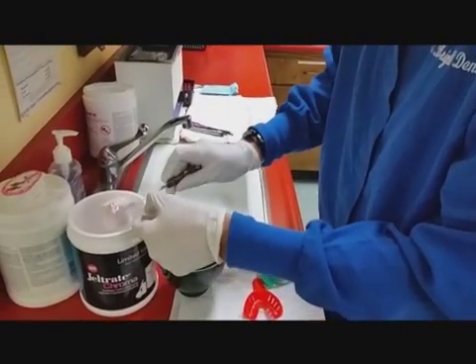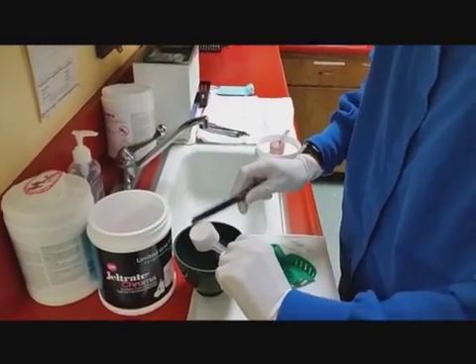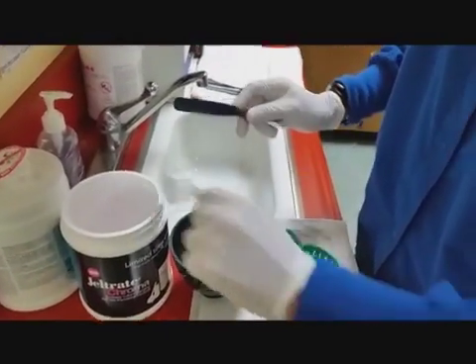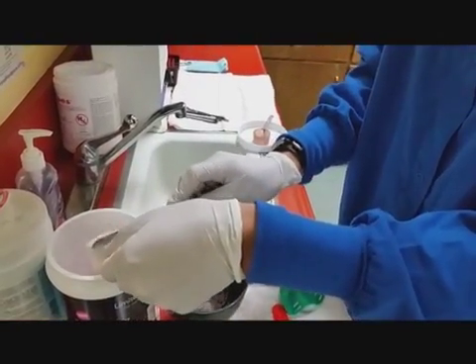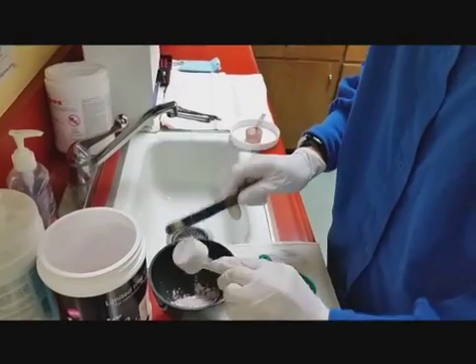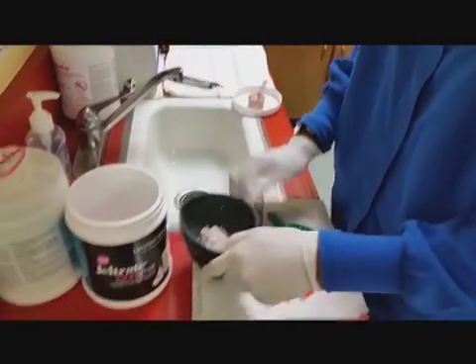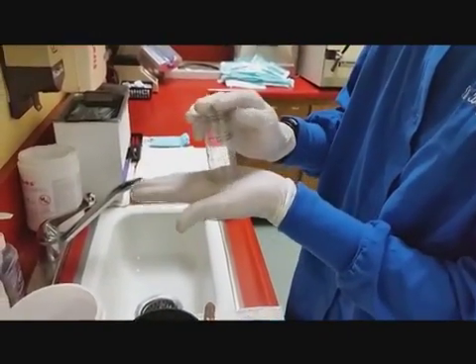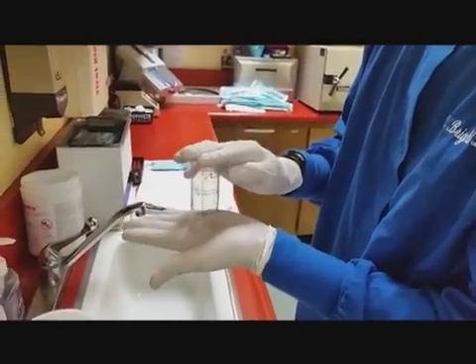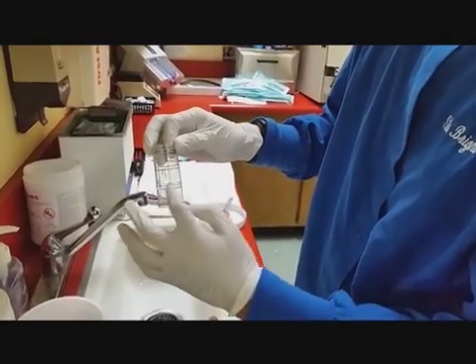Okay, alginate. So it's two scoops. And this is our measuring cup, where for every 1 scoop of powder it's 1 line of water.